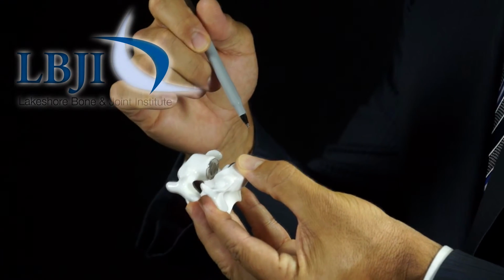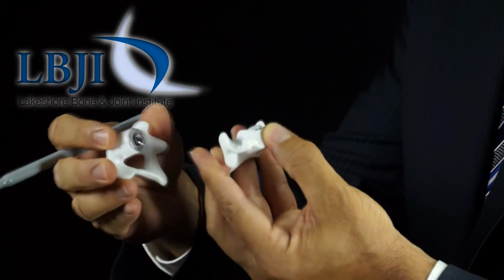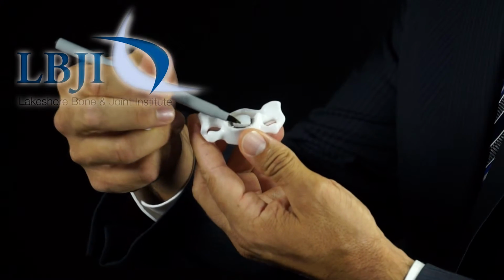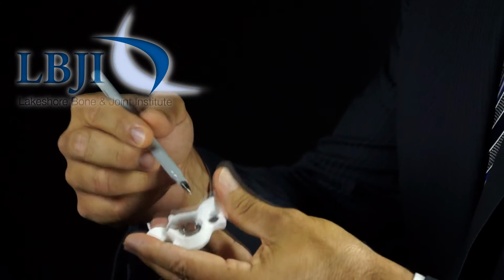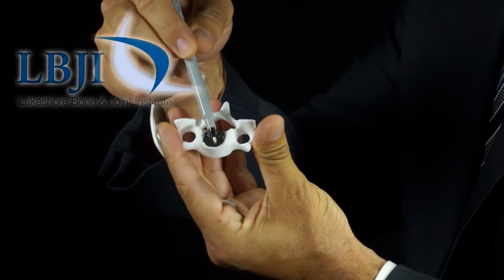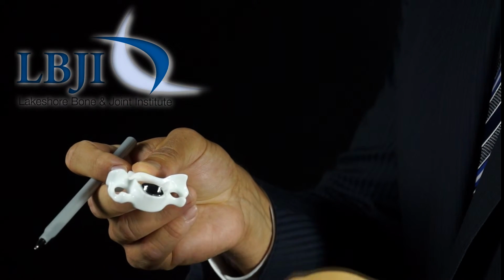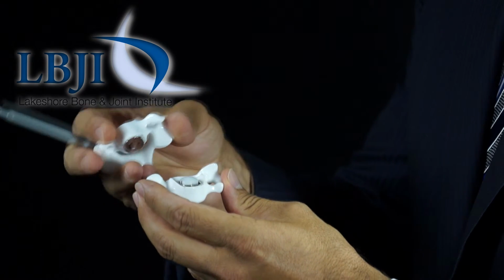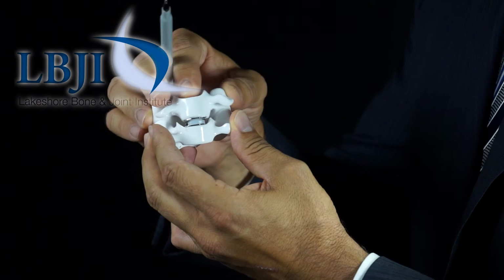Once the disc has been cleaned out, we prepare the end plates and size up the space where the disc used to be for the appropriate sized artificial disc. The artificial disc consists of 2 metal end plates and then a mobile polymer in between, which is held into place by the 2 retaining pegs, which can be seen here and here. With that polymer as an interval spacer, it functions to provide motion at that level of the cervical spine in flexion, extension, lateral bending, and rotation.